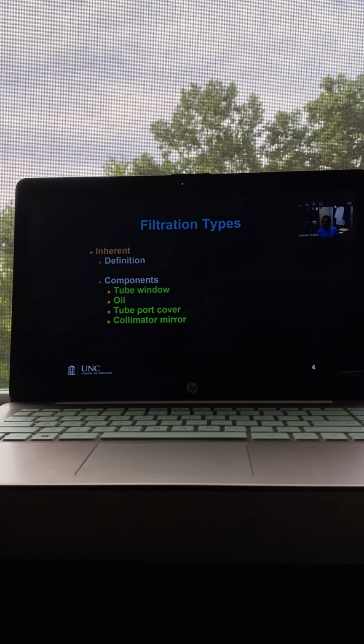Okay, the oil that the tube is immersed in. What did we say the purpose of the oil is? What does it do? Dissipates heat and protects against electrical shock. Yeah, exactly. It helps to dissipate heat, to get heat away from the tube. Because we've got several thousand degrees that ends up being built up in that tube, just from one exposure.